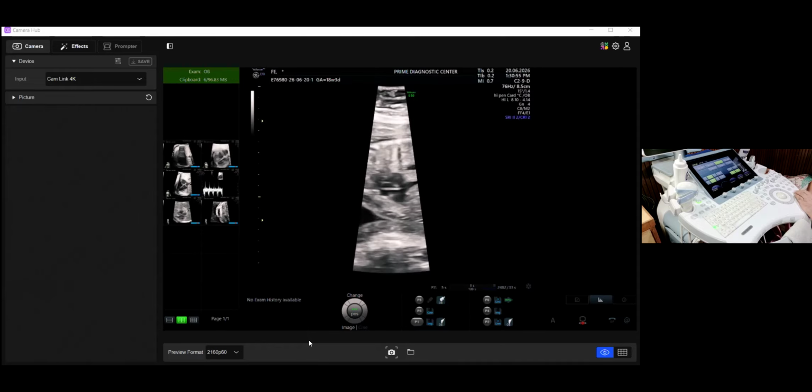I'm not seeing the superior vena cava yet. And that's an aortic arch, which is more curved. Anyway, I don't think that struggle is worth it. We'll do it when it is seen very nicely.